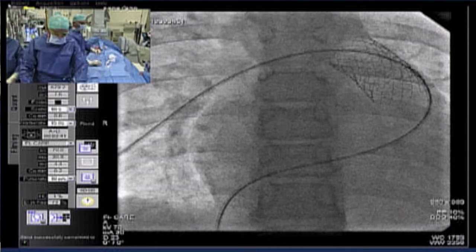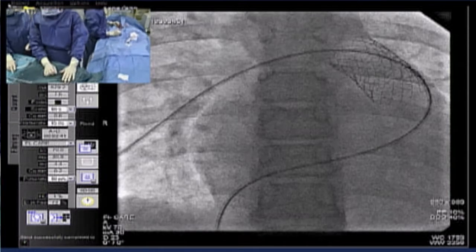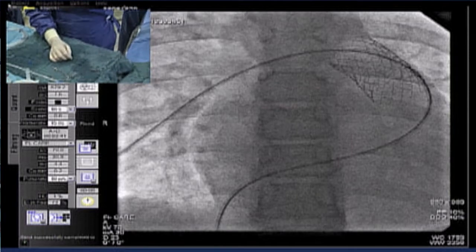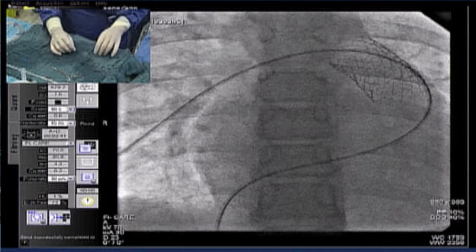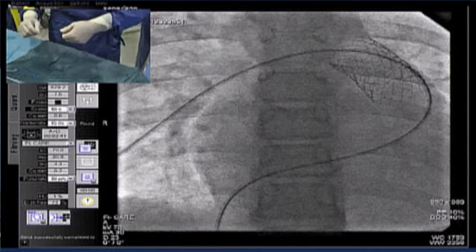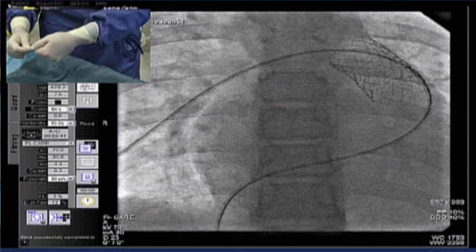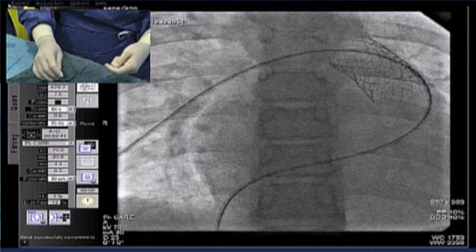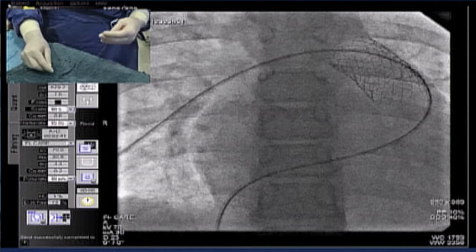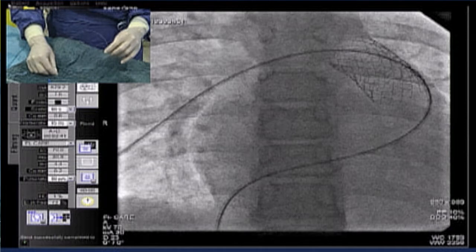So you could see that the Thermo exchange gives enough support to get that right coronary guiding sheath in place. Now that guiding sheath is big enough to take 2 wires. So now I can put my other wire next to it, but I will pre-bend it. The reason why I pre-bend it is I like to use this wire as an anchor into the pulmonary circulation. Can you show me my hands in the full screen? So you see there's a good pre-bend.